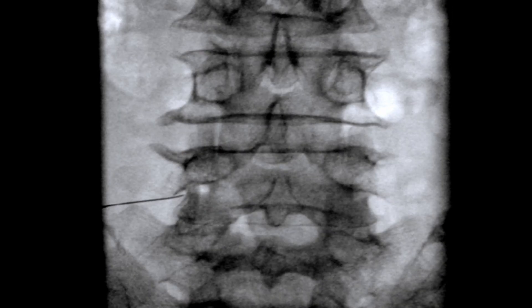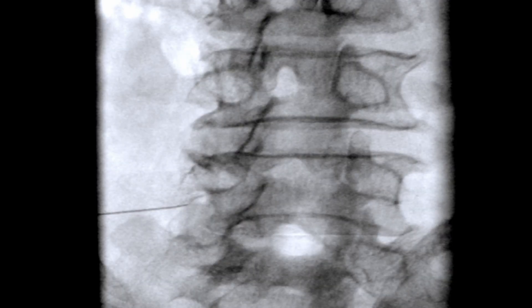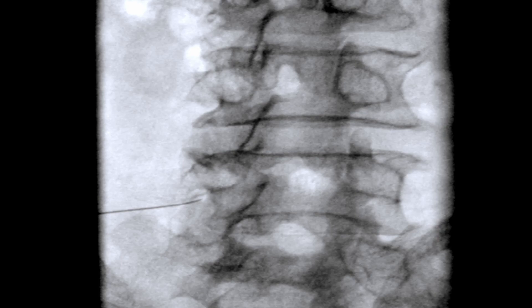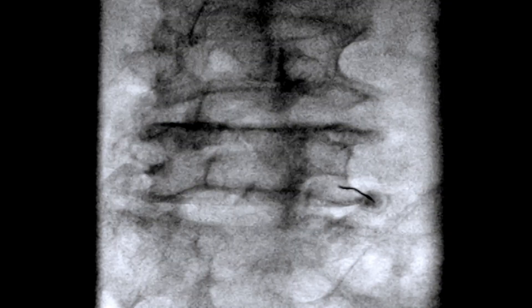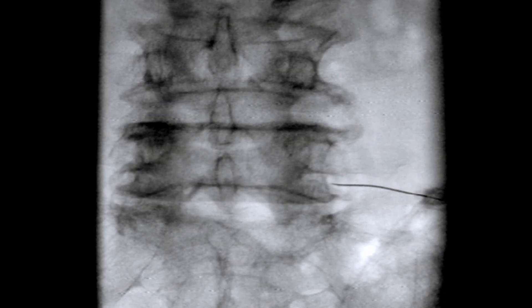Today, in Part 3, we spotlight the challenge of the needle needing to progress to the intended 6 o'clock position. Instead, we'll fine-tune our approach towards the circumneural sheath in the intervertebral foramen's external part. We'll also demonstrate the significance of verifying needle placement using the contralateral oblique perspective on the C-arm.